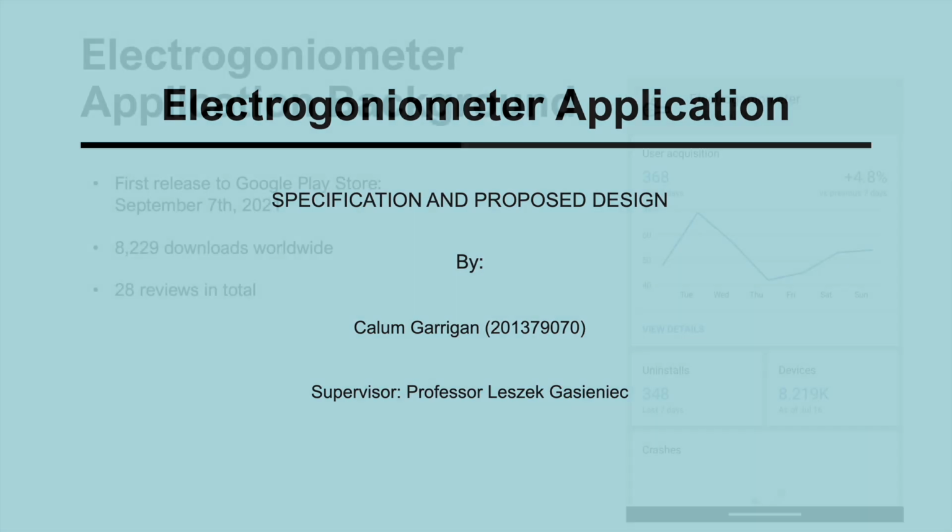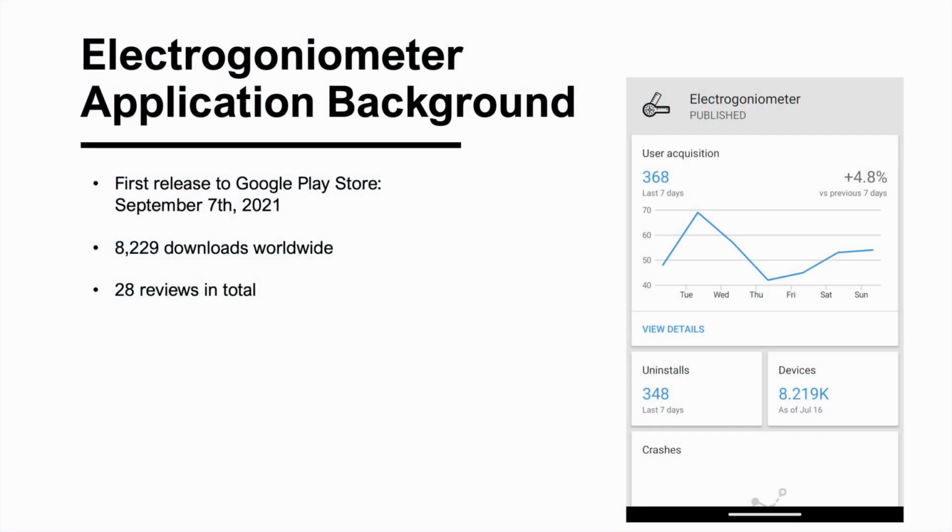Just to give a brief background of the application, essentially what the app does is it measures range of motion of angles, and measuring range of motion is important in the clinical setting. Measurements need to be accurate, especially when prescribing treatment to individuals with pathological movement. This is also important for patients returning from an operation and needing reevaluation.